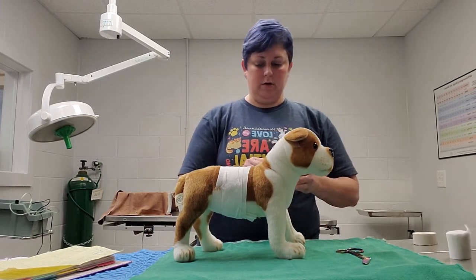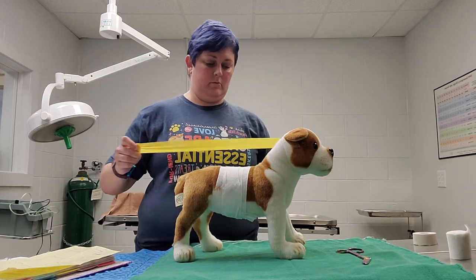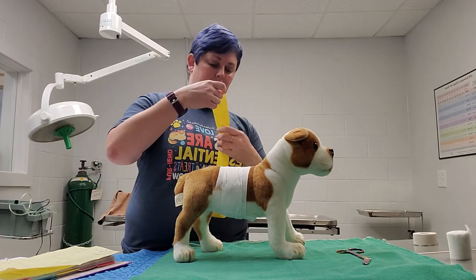Then we're going to use our vet wrap and roll it a little bit so it doesn't get too tight.